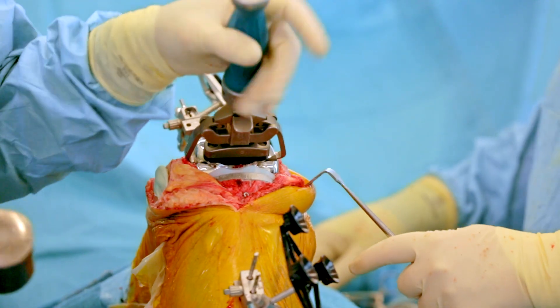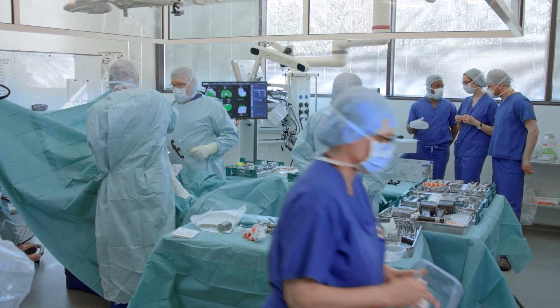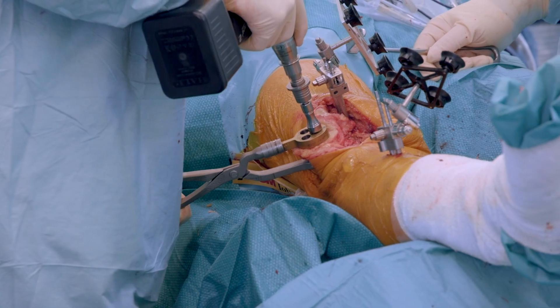The Mako robot is quite new to this country, but worldwide about 100,000 procedures have been performed. We already know that it produces very accurate implantation, and we've seen tremendous benefits: less pain post-operatively, less bleeding, patients in and out of hospital more quickly, quicker recovery, and better function. So it's already proving to be a remarkable tool.